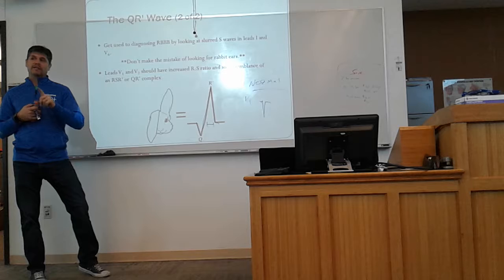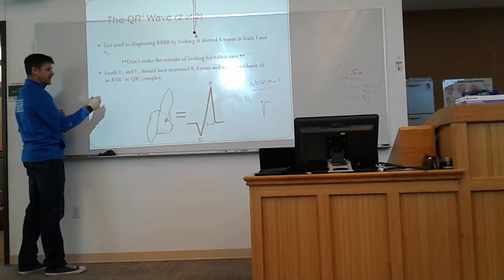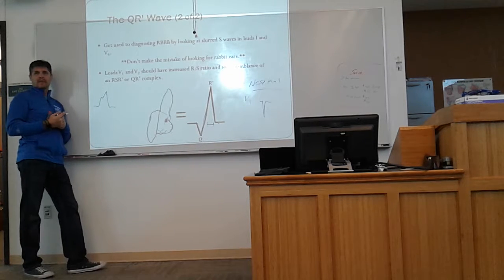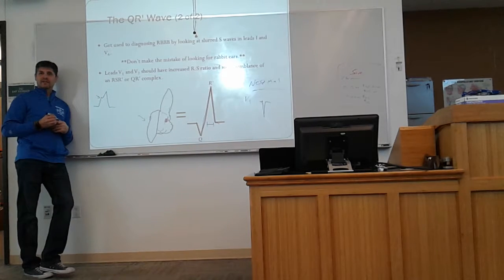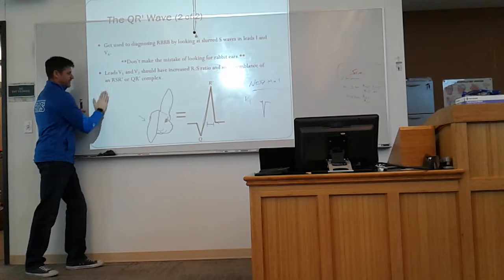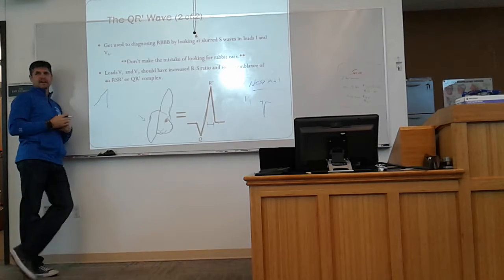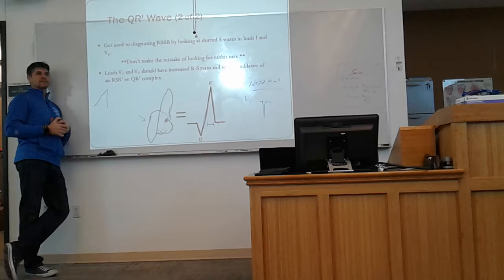So the trap that paramedics can sometimes get into is they're always looking for this pattern in V1. But sometimes we don't see that pattern. Sometimes we see that pattern instead. In fact, a lot of times we see this pattern instead, or we see it mixed up where you might have something like this, where you barely see anything at all. But you notice the QRS is wide.